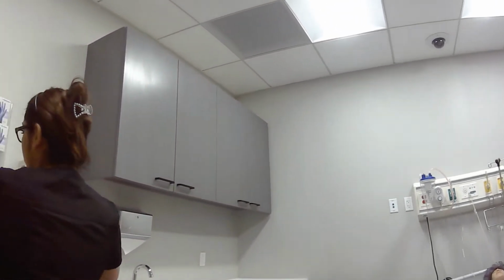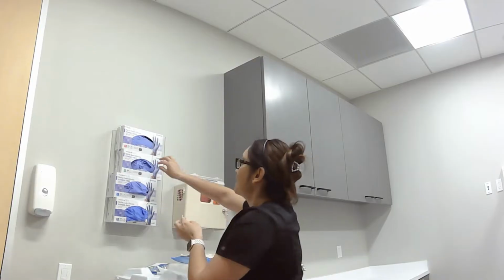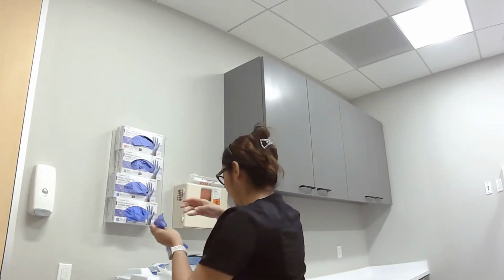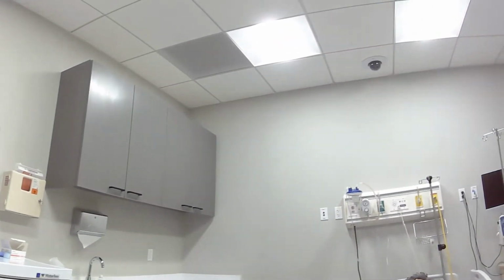So I'm going to do some hand hygiene, because you always want to make sure you do hand hygiene before and after all your procedures, and before entering the patient's room and before leaving the patient's room. And then I'm going to get my non-sterile gloves, okay? Get my supplies.